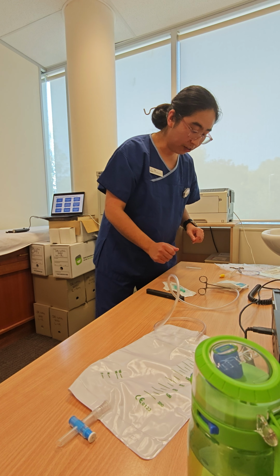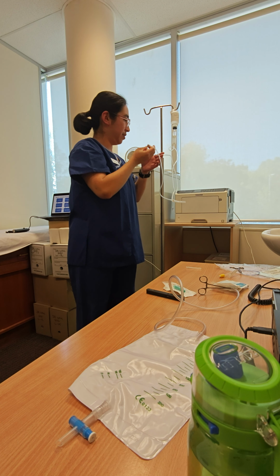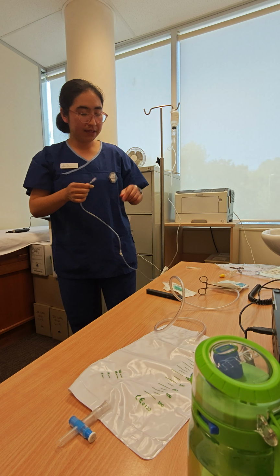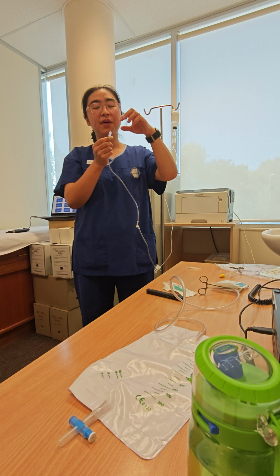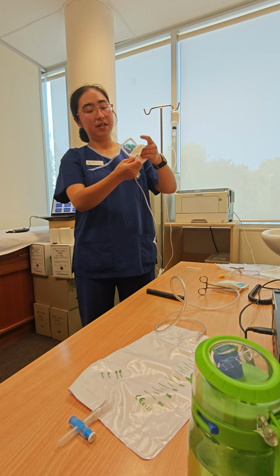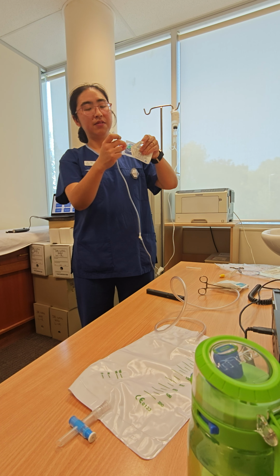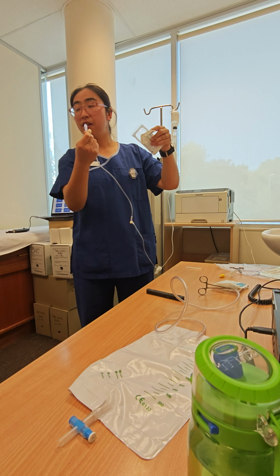Wonderful. Now, we're gonna connect our contrast to that catheter. How can we do that? Actually, there should be a tap there, but we just pretend. We turn off the tap. When I open the Christmas tree, just open slightly. This part, we can touch. We won't use that. But the inside is sterile.